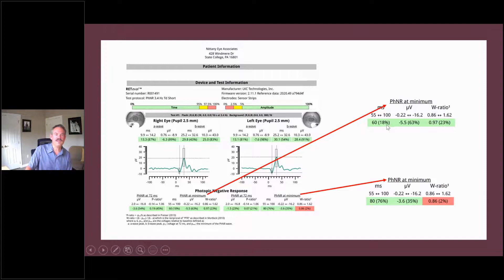What we're seeing here is the implicit time in the right eye is 18%, which is outstanding. The implicit time in the left eye is 76%, not nearly as good.